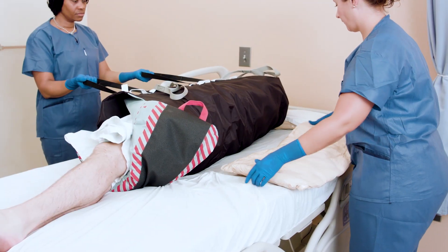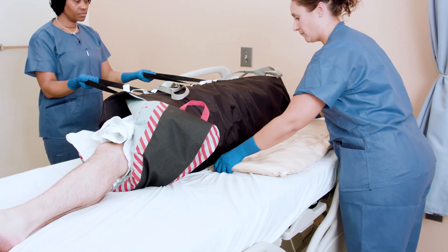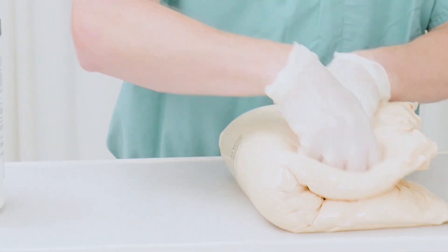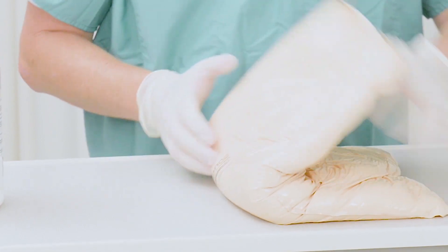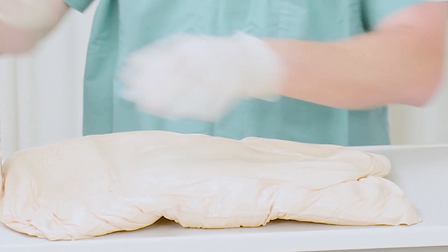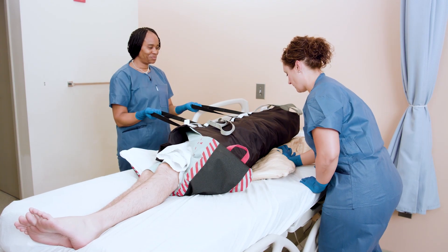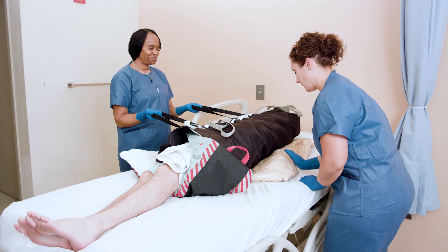Start with the positioner flat every time you want to reposition the patient. To smooth out the positioner, simply fold it in half, flatten it, and unfold it — it is ready to be shaped again. Never use the folded positioner for positioning, as it becomes very firm when folded. Remember: mold, don't fold.